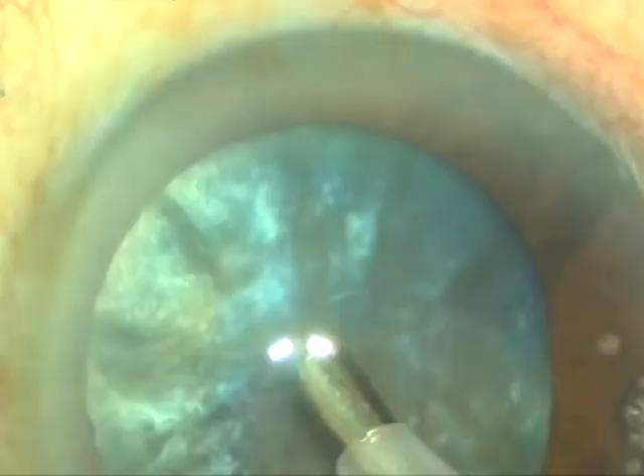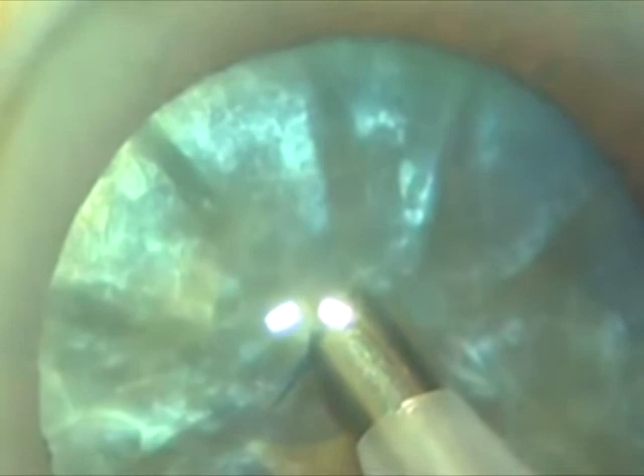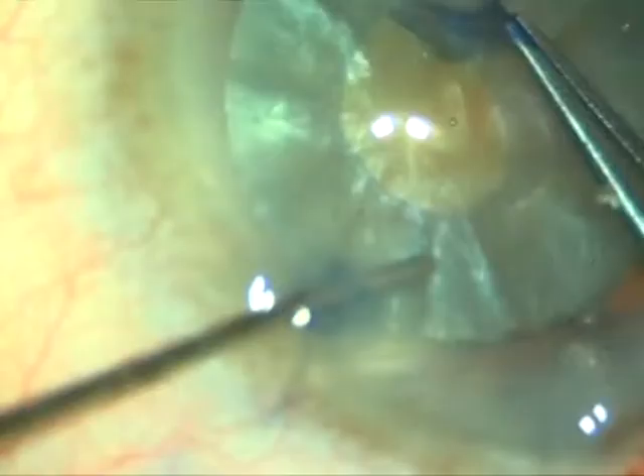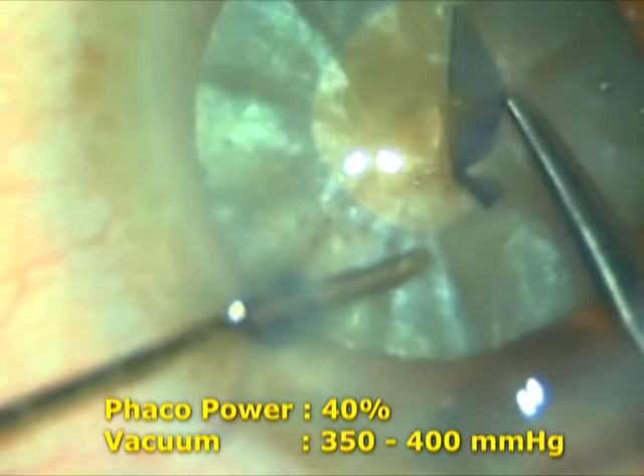A straight tip, either 15 degree or 0 degree, with bevel down, is directed down towards the centre of the anterior capsule. A sudden burst of phaco emulsification with a phaco power of 40% and a vacuum of 350–400 mmHg is used. Due to the sudden burst of phaco power, there is a sudden decompression of the bag, and the Argentina flag sign does not occur.